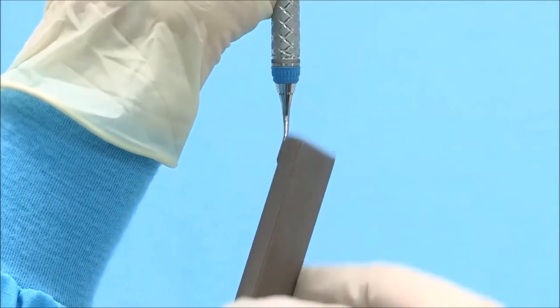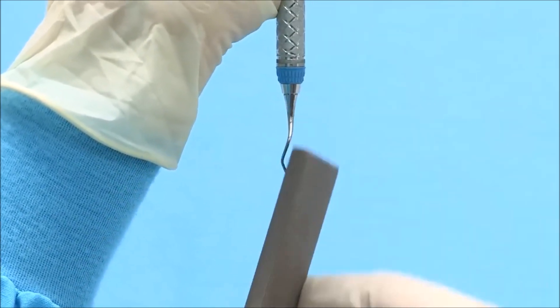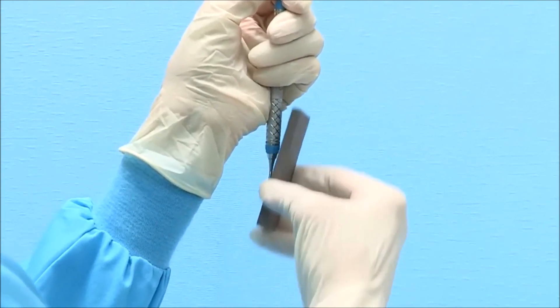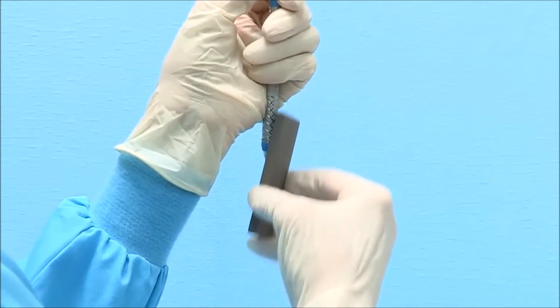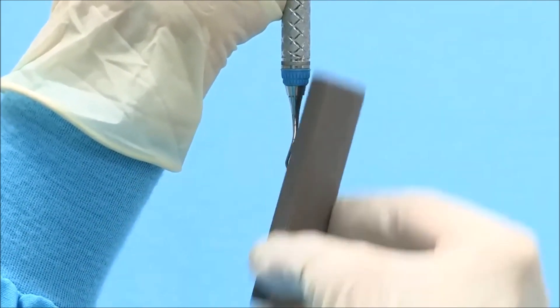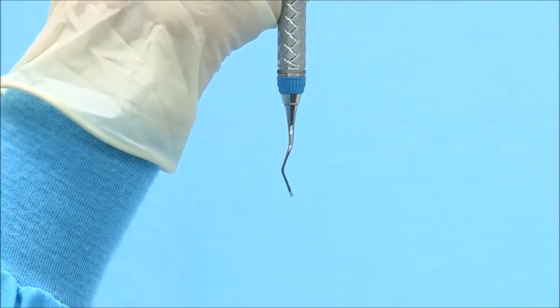Initiate sharpening in a consistent up and down motion starting at the heel third and continuing to the middle third and finally the toe third. It is important to remember that the blade of a Gracie Curette is straight and not curved. When sharpening, do not rotate the stone as you move from the heel to the toe of the blade. Instead, sharpen the blade of the Gracie Curette while proceeding in a straight line from heel to toe, as this will preserve the original blade design.